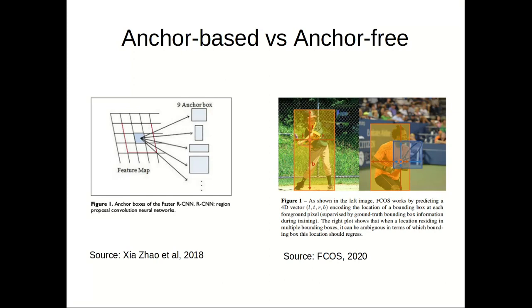Despite all this, after consideration, I chose for the current specific project not just to use non-region proposal methods, but also to keep it anchor-free. The basic concept behind my implementation lies somewhere in the middle between YOLO version 1 and the more novel FCOS algorithm. One of the reasons I chose not to use anchors and to try to directly regress the bounding boxes around the opacities is that in the 2020 FCOS manuscript, the authors demonstrated that there are indeed ways to direct the process toward multi-scale and multi-shape differentiation abilities other than only using predefined anchors.